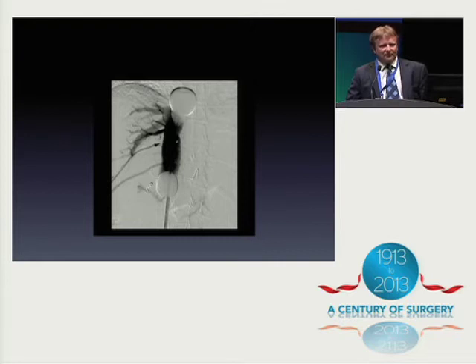During the procedure itself, there's negative pressure in here as the filtration system is sucking blood out from the IVC between the two balloons. So although there is some filling of the lumbars, unless they're massive, it's not usually an issue.